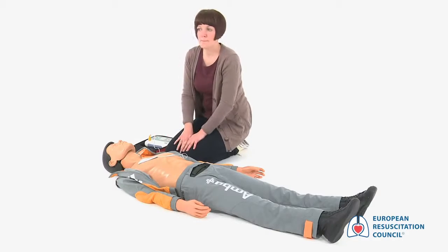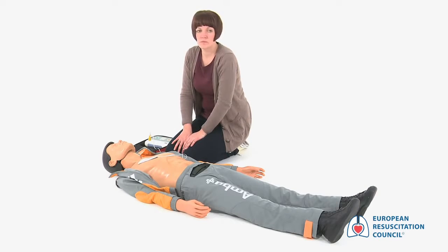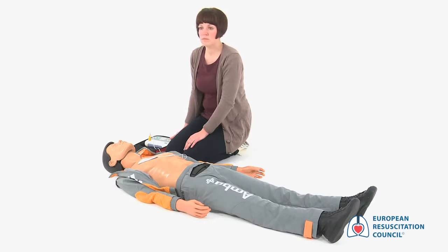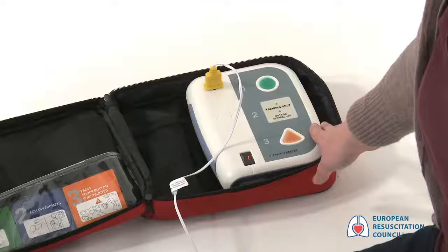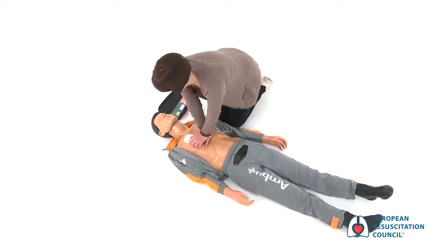Analyzing heart rhythm. Do not touch the patient. Staying clear. Shock advised. Charging. Stay clear of patient. Deliver shock now. Press the orange button now. Shock delivered. Begin CPR.